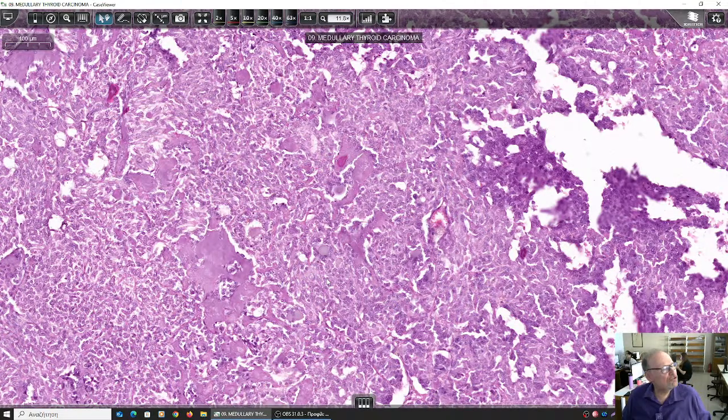Yes, I know. However, there are some potentially malignant tumors that also have homogeneous appearing cells. Which differentiation is it, of these tumors that have malignant potential and whose cells generally look like each other? Which ones? Which markers of immunohistochemistry will help us define this differentiation?